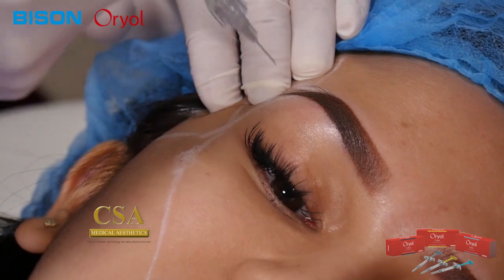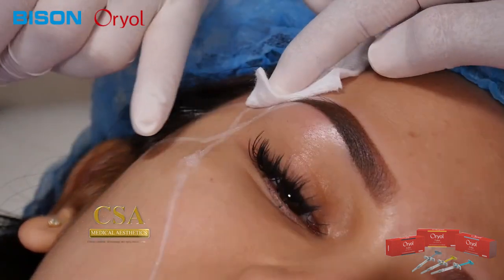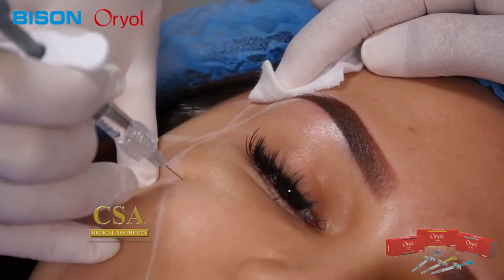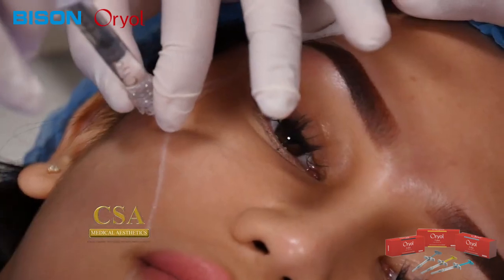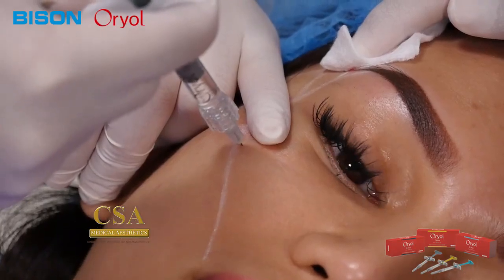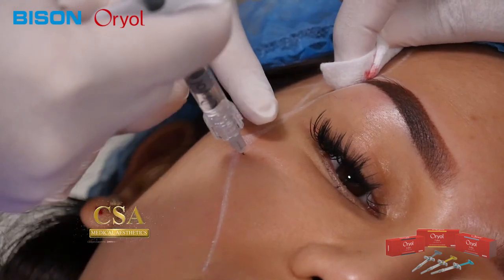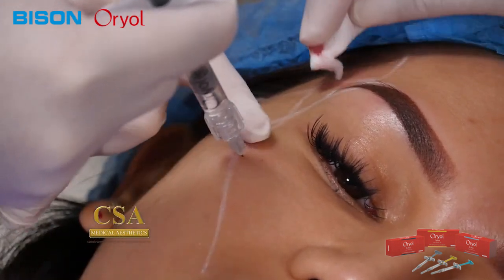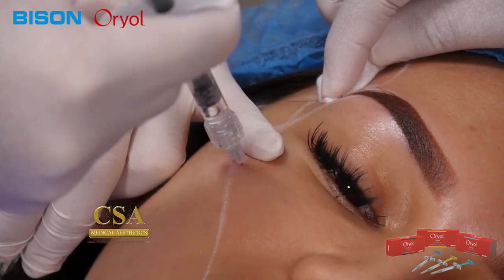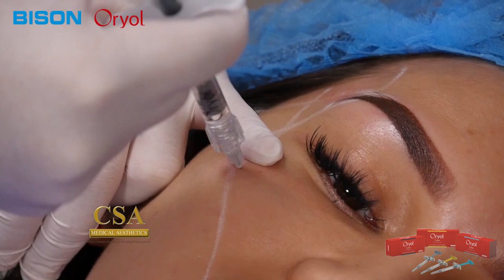Next will be my zygoma area here. So press on the injection point, apply pressure, and disinfect. I already have a marking there. The goal here is to improve that depression in this zygoma region. You want to fill in specifically the so-called zygoma prominence, or the malar prominence, and I'll be injecting about 0.2 to 0.3 of my product here. This will give a lifted cheek region, restoring your cheek's OG curve, as well as reducing your nasolabial fold. This will also be very good for lifting the cheek region if you're starting to notice some cheek ptosis or cheek sagginess, improving your mid-cheek groove. Okay, there you go.